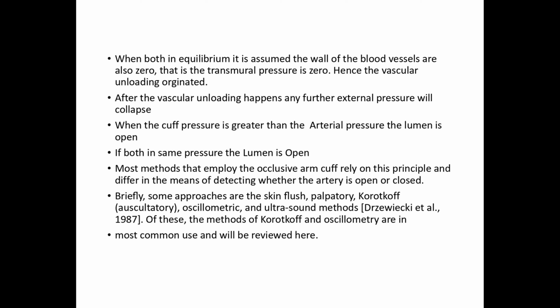There are approaches called skin flush, palpatory, oscillometric, ultrasound, and Korotkoff sound methods.